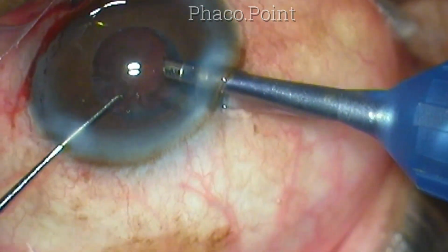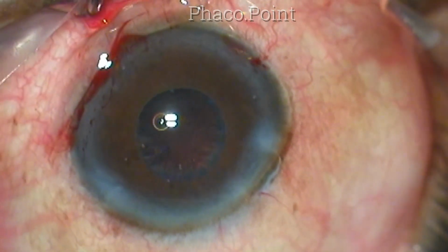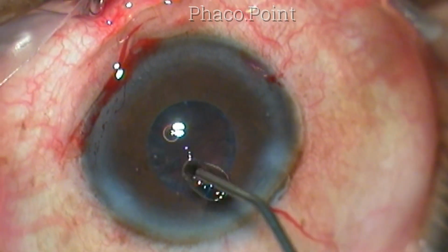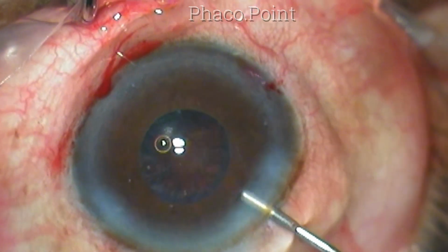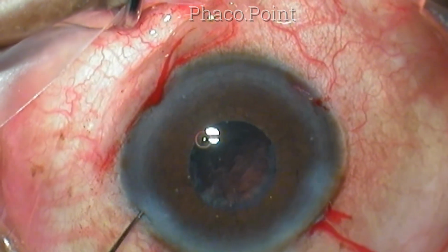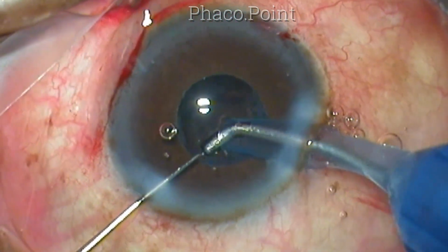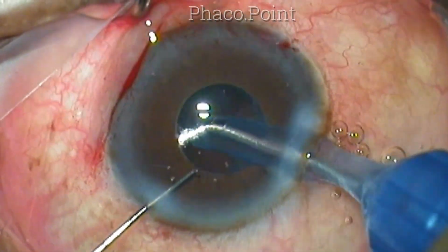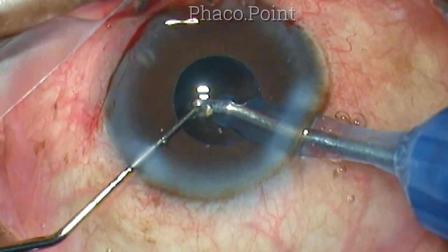So that's it. The fragments have been completely removed, and now we move to cortex aspiration. I use the coaxial IA cannula for this purpose. Even though the pupil is small, you can see the cortex peeping out through the pupillary area, and you can grasp onto this cortex, make slight side to side movements to free and loosen it from the capsule, and then draw it towards the center.